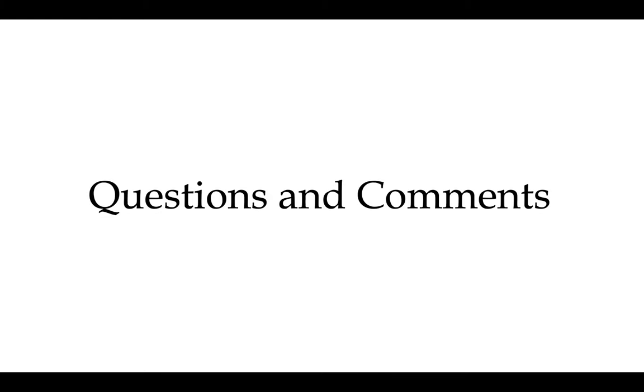So it will be helpful, potentially in the future, to look at a specific classification system for these abdominal or oblique strains, as well as return to play and whether imaging can help guide that, just because a lot of these injuries can be very prolonged in athletes. So those are just some of the comments I wanted to make, but I'm going to go ahead and stop sharing my screen so I can see if anyone else has any other questions or comments.